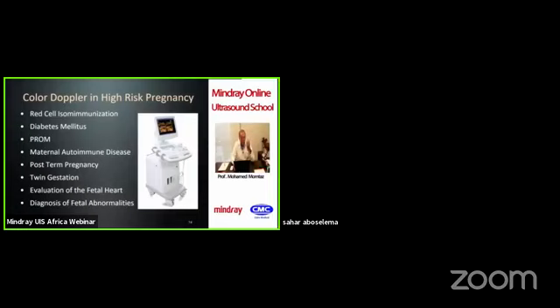And if you have a result back to you, an SD or an RI or a PI or a value, you know what this value means. Doppler will help you a lot in decision making in obstetrics, especially in cases of IGR and placental insufficiency, where monitoring of these cases is based primarily on Doppler ultrasound. Many obstetricians think that they don't need to know a lot about Doppler because they have a fetal medicine specialist or an ultrasonographer who will do the scan.